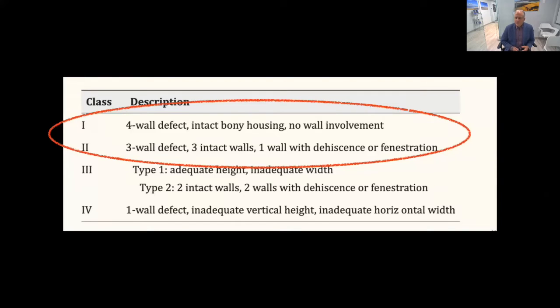And cone beam imaging really allows me to predict those types of situations, because if I see something in a cone beam that I don't want to handle, then I'm going to refer that to my oral surgeon. And I have a great relationship with my oral surgeon. He's actually in the same building as I am, and he's a mentor to me and actually trained me to place implants. And that sounds kind of strange that an oral surgeon would train me and then let me be on the first floor of his building.